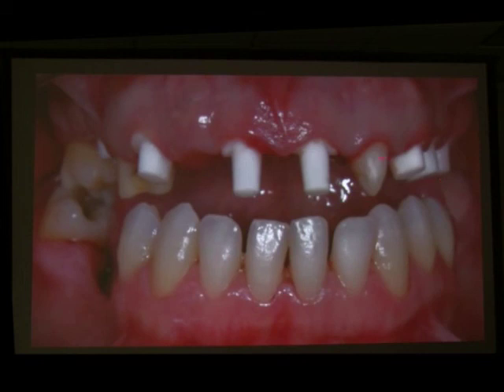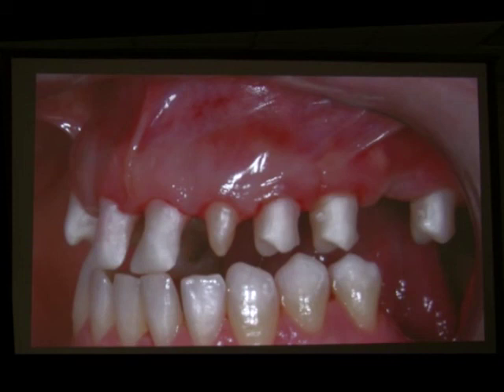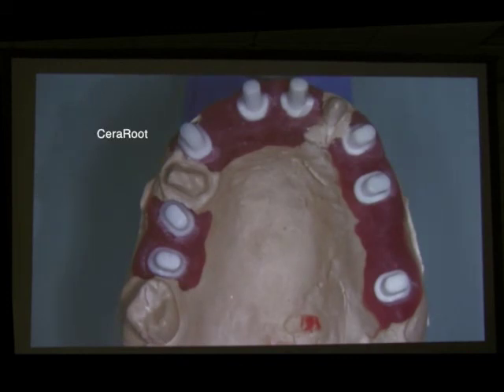And we do a little bit more prepping on the teeth, but we decide not to prep any implant. So even if there is an exposed margin, we decide to do a conventional impression technique using the copings. We have more than 1 millimeter supragingival implant here. It's on the posterior side. The patient will probably not even detect it. And because all the margins are supragingival or at gum level, the copings stay on the implants very easily. And we take a pick-up impression, and in the lab we have lab analogs because we didn't do any prepping on the implants, so we can use the same analogs.